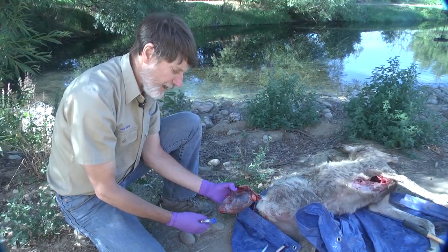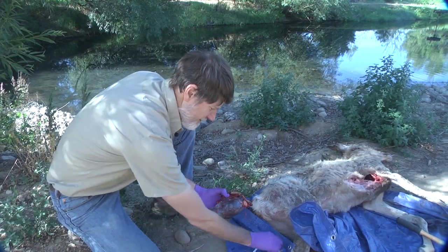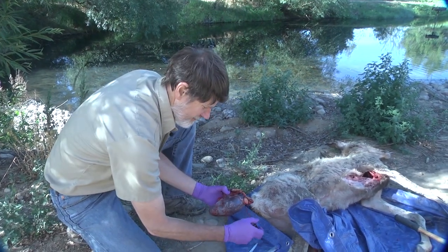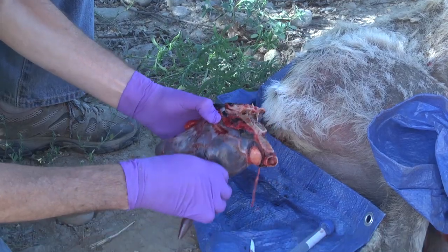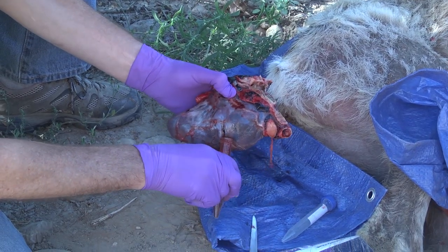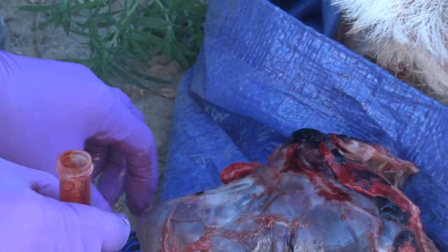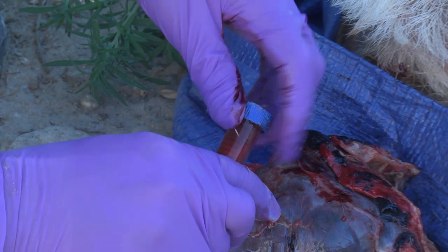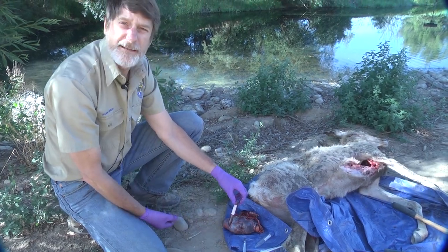You can also get a blood sample out of the heart. Our tube is ready to fill. We put our cap on, and now we're ready to get it ready to go in the mail.